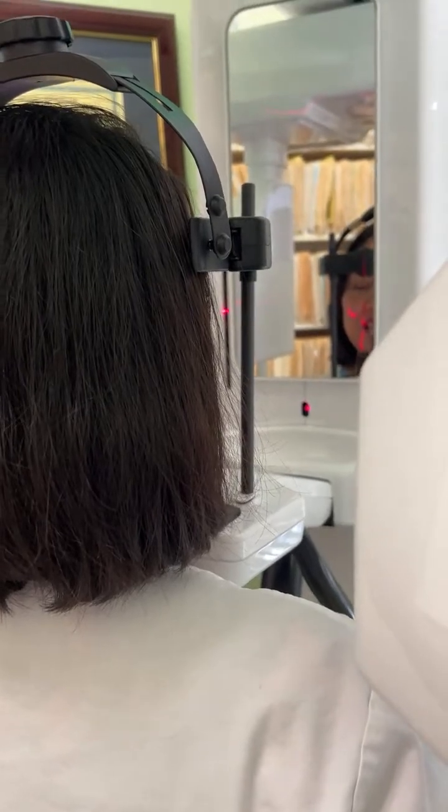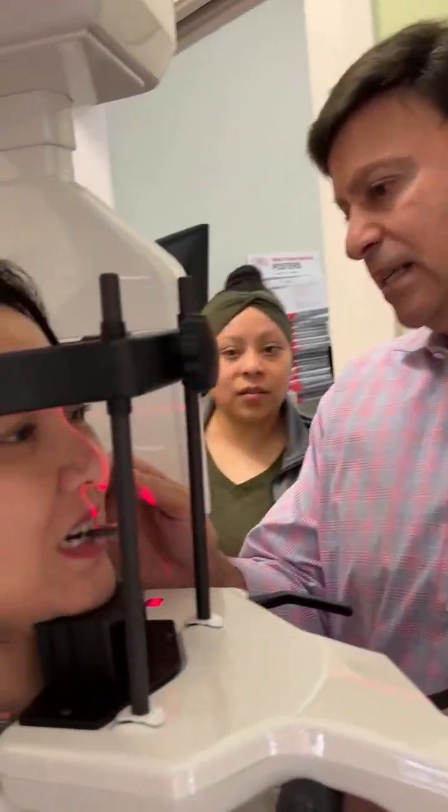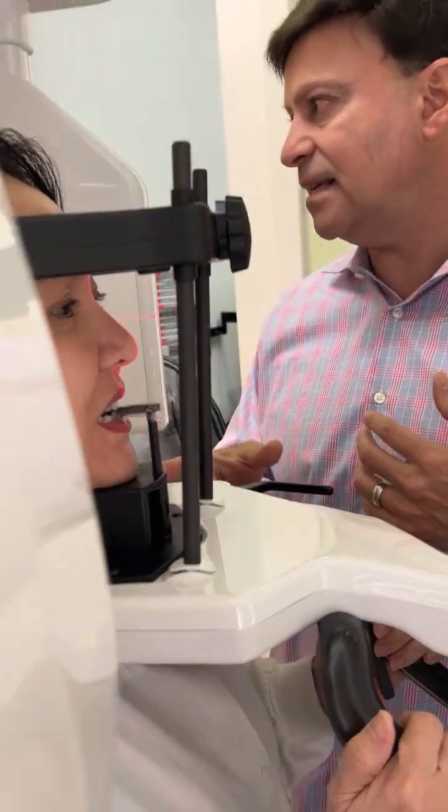Okay, hands are up here. Walk forward until you touch my foot. Okay, she's under the machine. Apron is optional. If I were to take this on you, I'd remove your earrings, nose rings, tongue ring, eyebrow ring, anything like that, necklaces. Anything from the neck up needs to be removed.